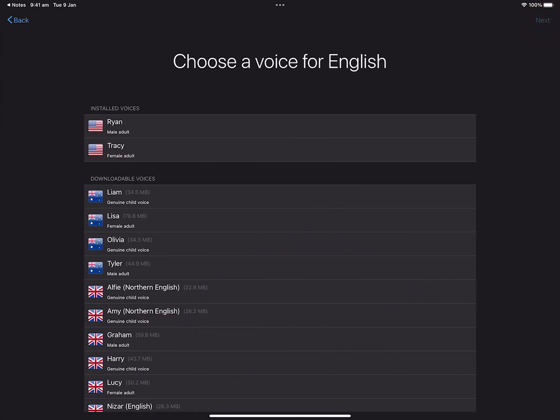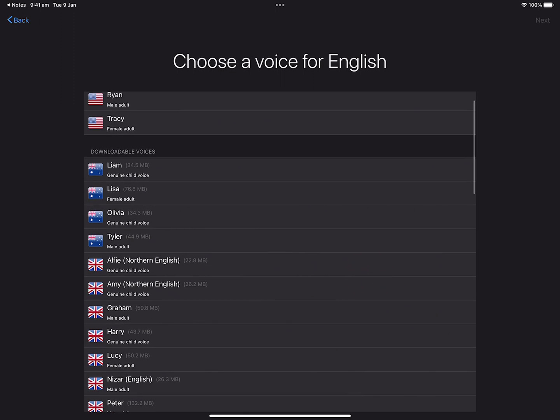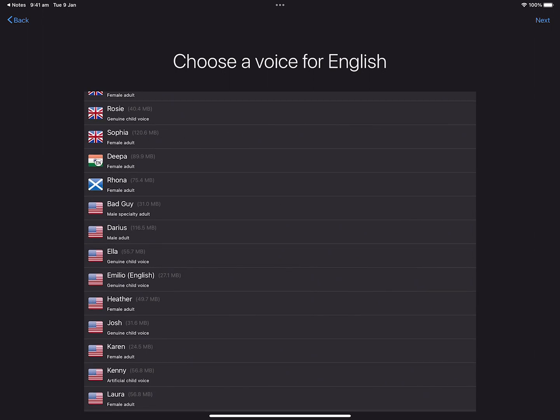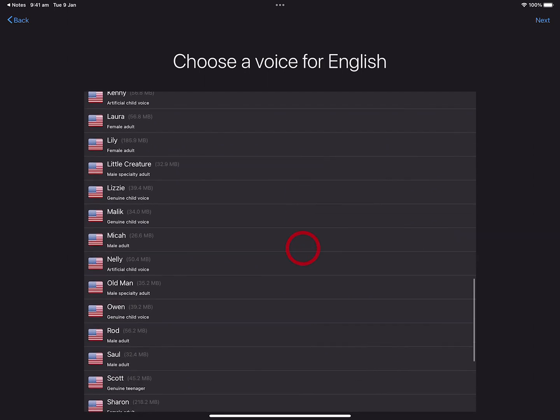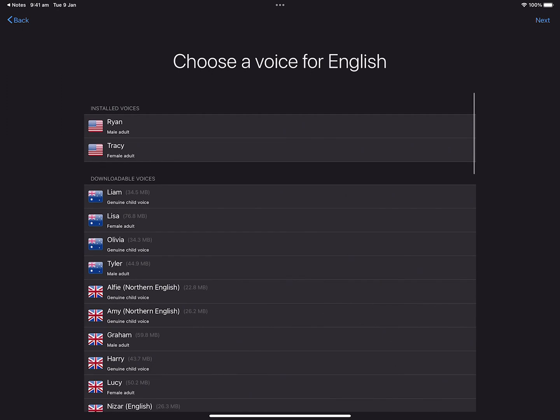Now is a fun decision — what voice will Proloquo2Go use when it speaks out loud? There are lots to choose from. You can tap them to listen to them. This is a great chance to involve the person who will be using Proloquo2Go. Sit and listen to the different voices together. Let them choose the voice that suits them. There are many different voices to choose from: children, teenagers, and adults. I'm in Australia, so I'm going to choose Lisa. Then tap Next.